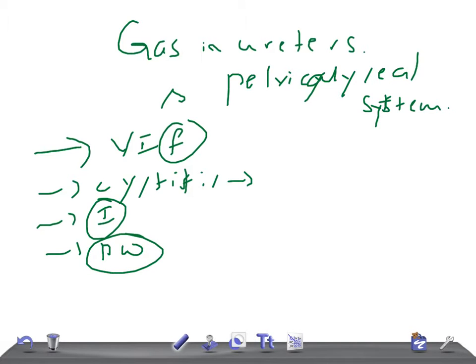These can give rise to gas in the bladder, and that gas can go and get stuck in the ureters. So some other causes can be ureteric diversion.